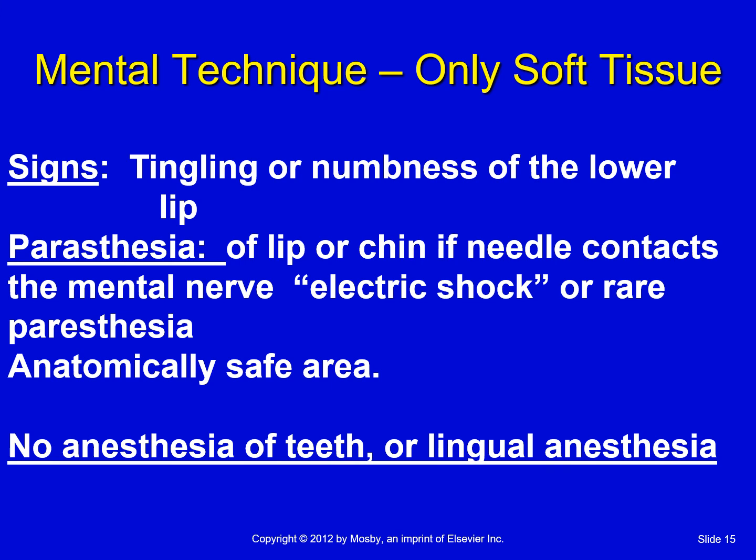There's plenty of times it doesn't happen, but you're probably going to give a mental block in your lifetime that does give a shock. Just be prepared for it. It's not a big deal. This is another example of needing to have a really firm fulcrum so that if they jump a little bit, it doesn't cause you to pull out of the tissue.